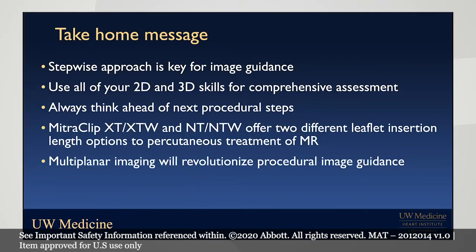So now I'm going to summarize briefly what we talked about, and we will also have opportunity for discussion, but certainly it's important to consider a stepwise approach that is really key for successful procedural image guidance. It's also essential to use all of your 2D and 3D skills to not only assess the mitral valve comprehensively, but also guide the procedure at times with 3D and biplane imaging.